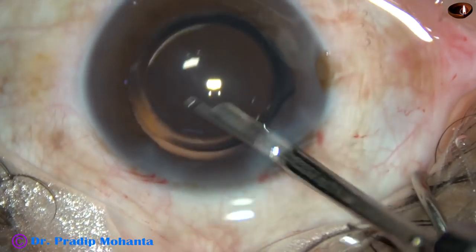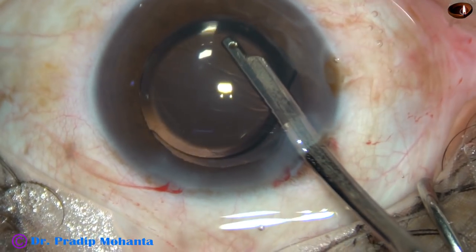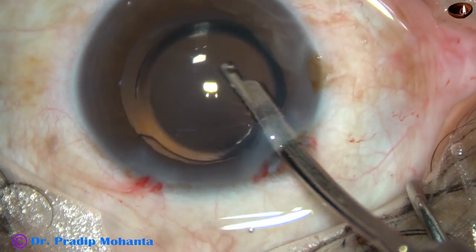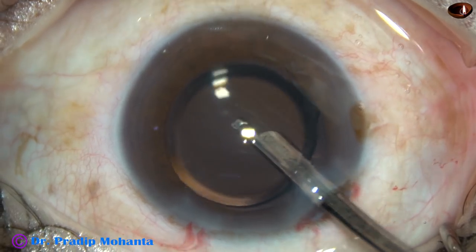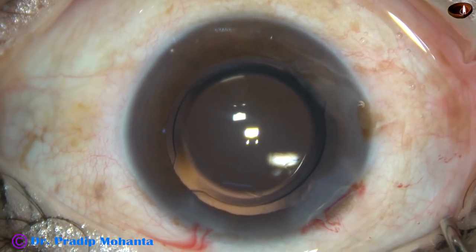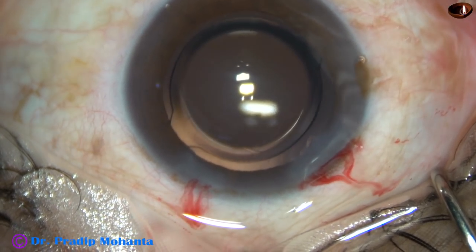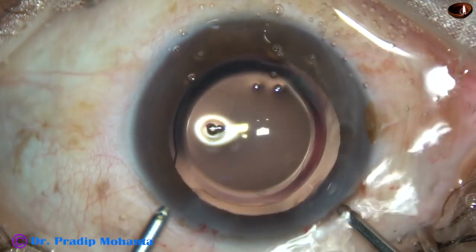I do this step very religiously, taking a lot of time, very gently. First, I use Simcoe and remove most of the viscoelastic substance — first by irrigation and then by irrigation and aspiration. And then I use the bi-manual irrigation-aspiration for removal of the rest of the viscoelastic substance.